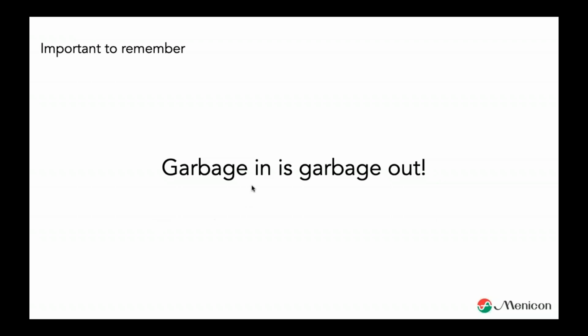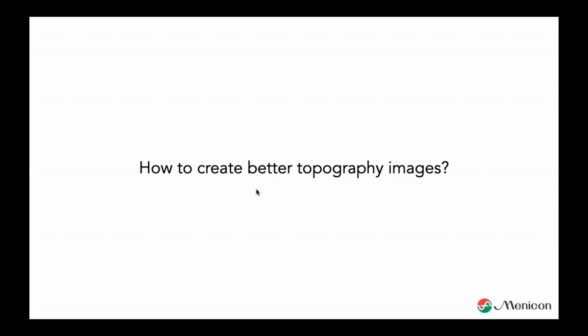But when you just don't put enough effort into creating a good topography image, what do you expect from the end result? A lot of people think, oh, now I have a very expensive device. I press the button and the topographer is doing everything for me. Well, no, it's not happening. You are still the specialist. You have to decide which topographer map is useful and which is not. So again, garbage in is garbage out. That brings me to the point of how to create better topography images.